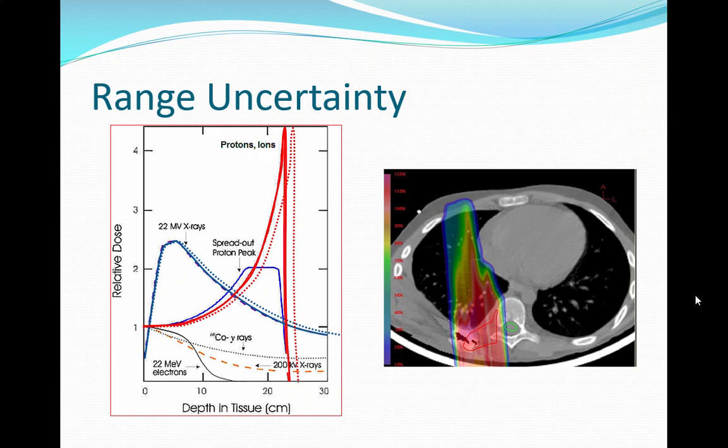This is what I was mentioning about. Imagine I took the Bragg peak and I missed, right? So my tumor's here. I go a little bit long, right? Well, what it hit with high dose is some nearby critical structure. And so usually when we're doing this, it's not like on your arm where you can miss and it's okay. This is inside your brain. I miss and you can't walk again, or you forget your family, or stuff like that. So we really don't want to miss. We want to hit as accurate as possible.